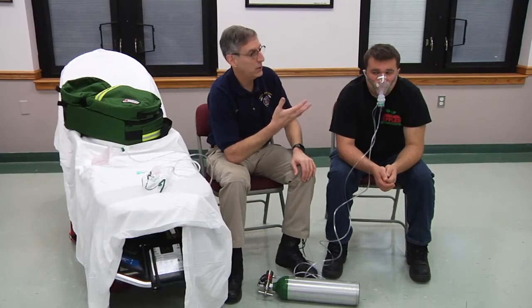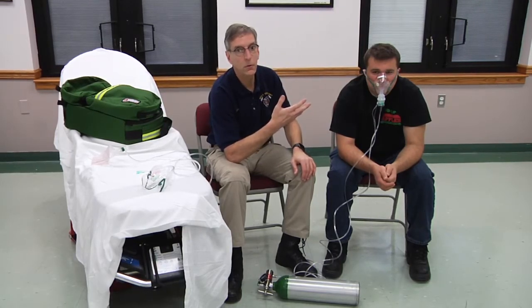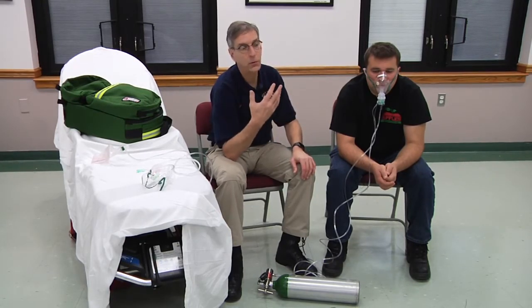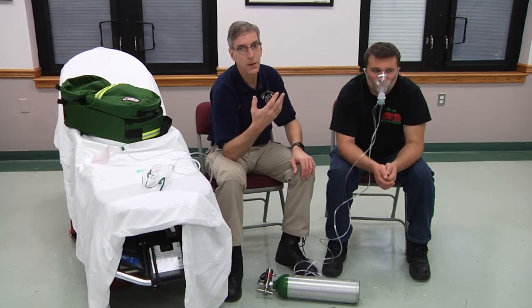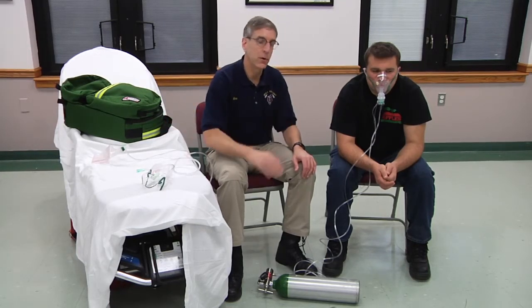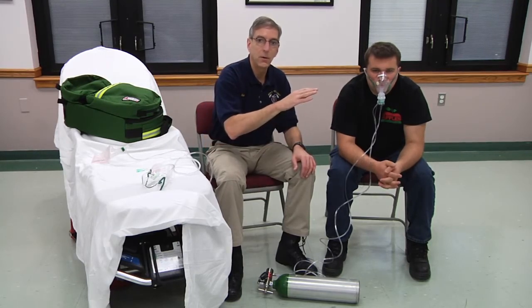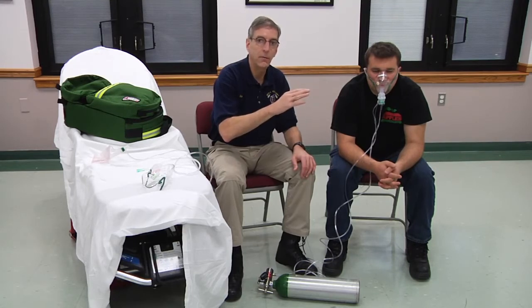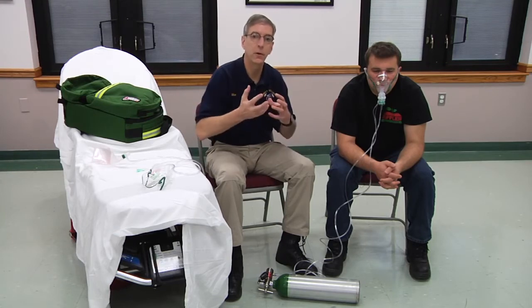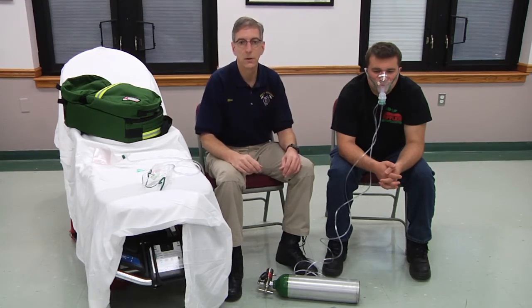If the patient's saturations are low while you're administering the nebulizer, you could take the nasal cannula that the patient was on — or perhaps a capnography device that's a nasal cannula — and plug that into a second oxygen cylinder to deliver extra oxygen to the patient. You're not going to get 90 or 100% oxygen out of a nebulizer treatment because it's pulling entrained air from the atmosphere in order to aerosolize the medication being delivered.